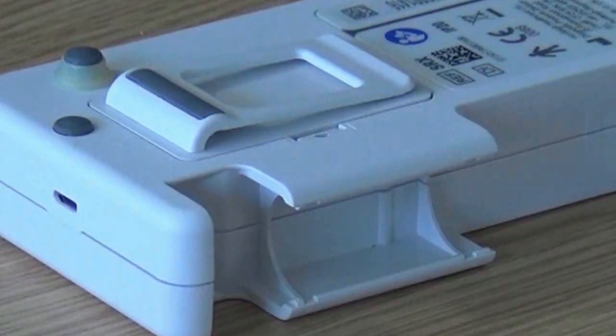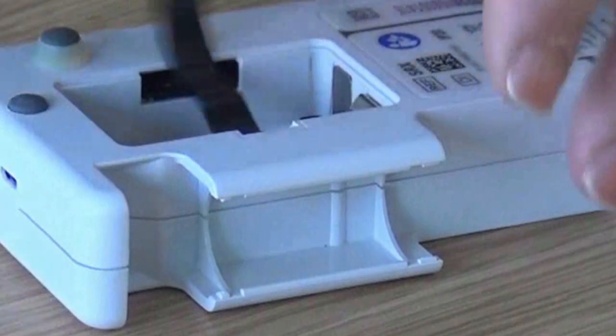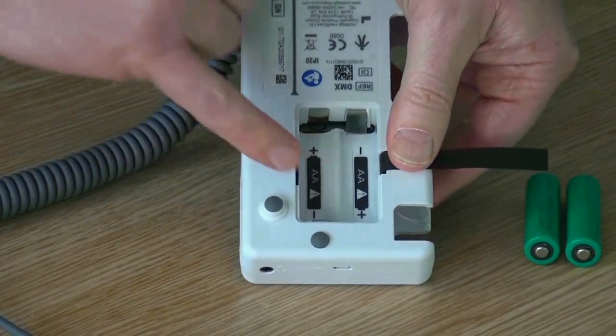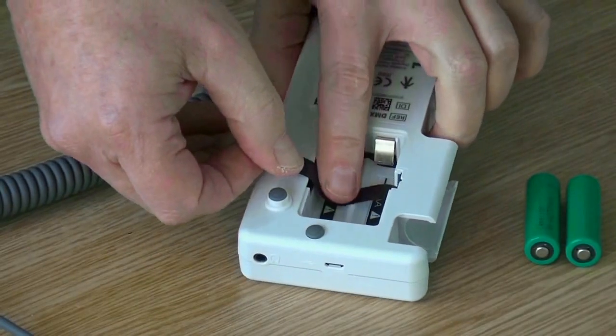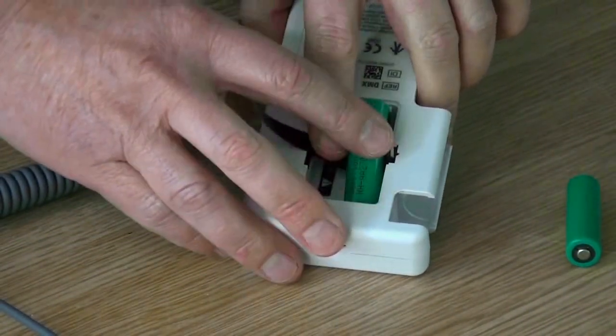With the Doppler lying face down on a flat surface, use a small tool to unclip the battery case. You will see a helpful illustration on the inside of the case showing the correct positioning for the batteries. When inserting the batteries make sure that the black strip is placed underneath and re-clip the battery cover.